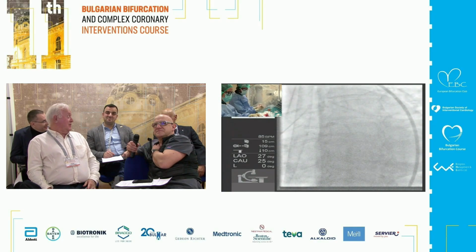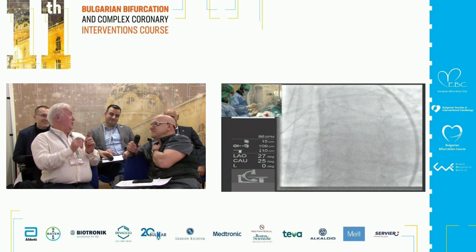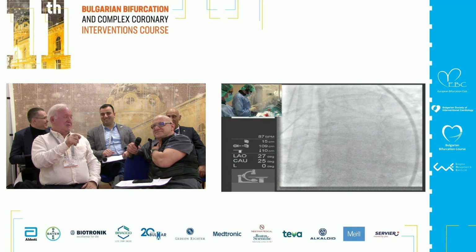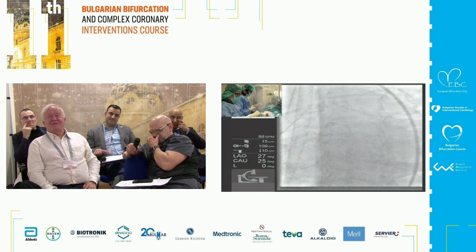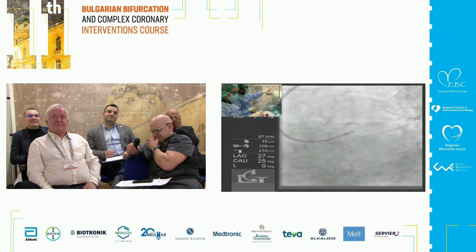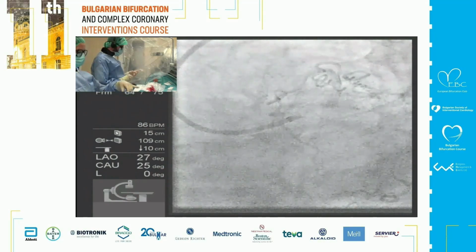What do you think about imaging? Yeah, there's no wire, but there was a small wire at the tip of the balloon. I used it in the early 80s. At that time, a bifurcation was treated with 2 9 French guiding catheters.